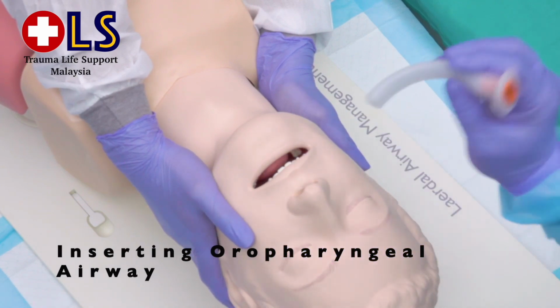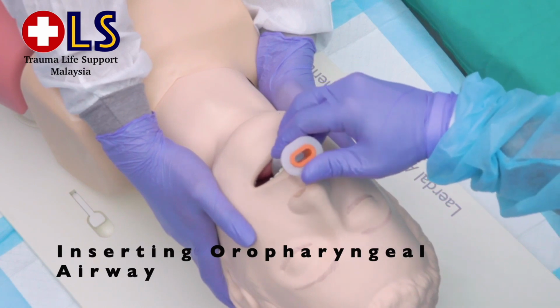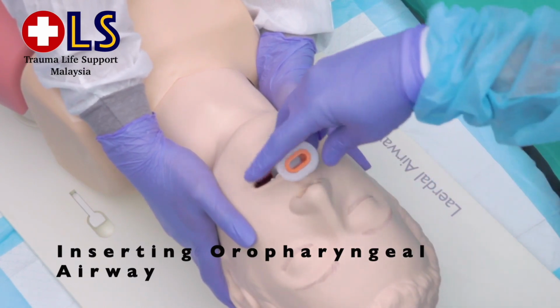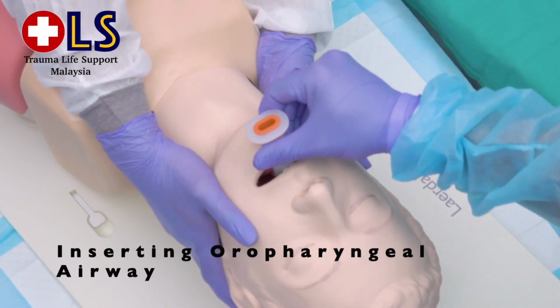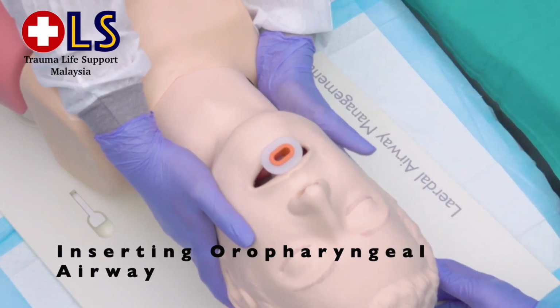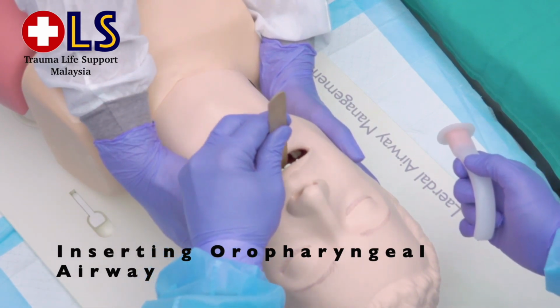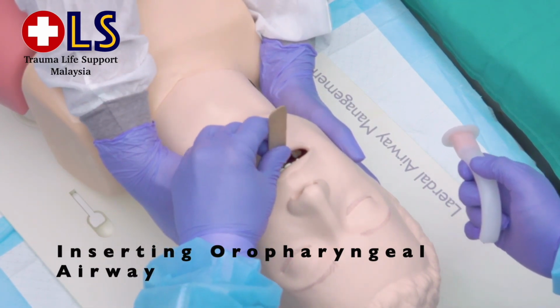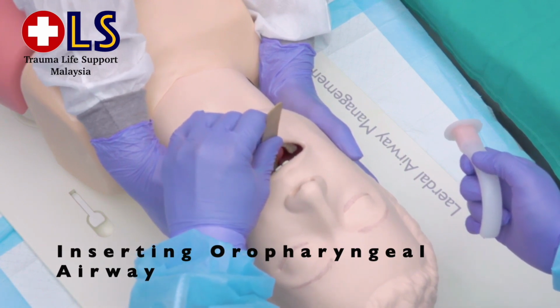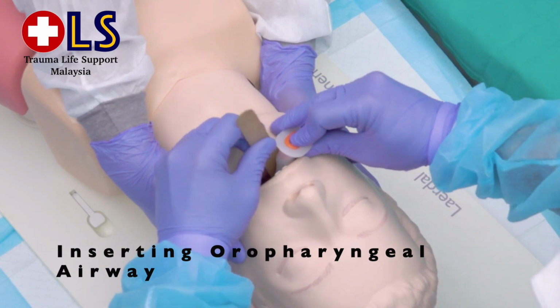So once you get the correct size, place it this way into your oropharynx until you hit the hard palate. Turn it around 180 degrees and push it in. Another method that you can use is a tongue depressor. Gently insert your tongue depressor, gently depress your tongue caudally, and place the oropharyngeal airway directly.